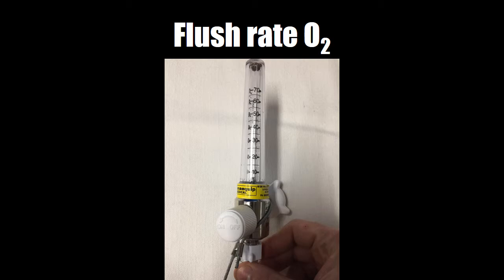But it's clearly labelled, and as opposed to the overcranking system, we actually know what we're doing here, and we could easily switch these out so that they're in the intubation trolleys for use for pre-oxygenation. The benefit of using the non-rebreather mask over the bag valve mask is that you don't need somebody standing there with a seal onto the face. That's the big drawback of using the bag valve mask. If you're not sealed onto the face, you're actually just giving room air.